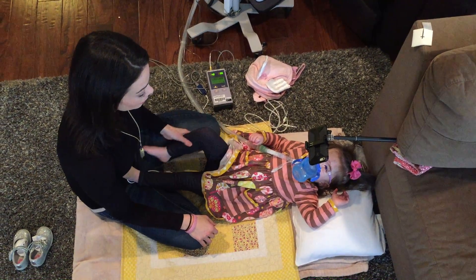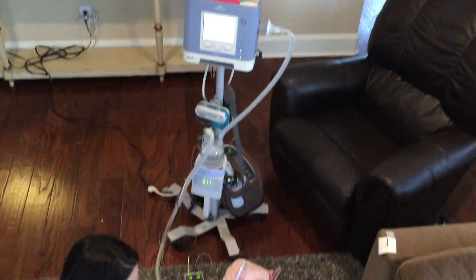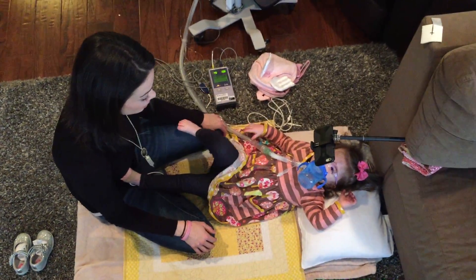Christina is up from her nap and we have her on the ventilator circuit still attached. I'm about to put her back on her diaphragmatic pacers.